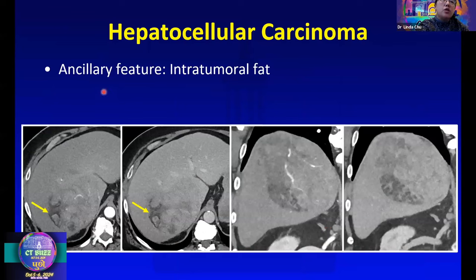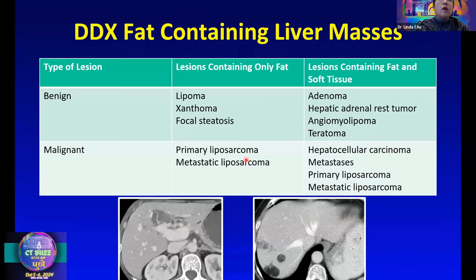This case nicely shows the ancillary feature of intratumoral fat. We have a very heterogeneous-looking mass with some internal fat. Having fat in a liver mass is a helpful feature because it narrows the differential to either HCC or adenoma. If you see a fat and soft tissue containing mass in the liver, we are typically encountering either adenoma or HCC. Other things on the list include hepatic adrenal rest tumor, angiomyolipoma, teratoma, metastases, and liposarcoma.